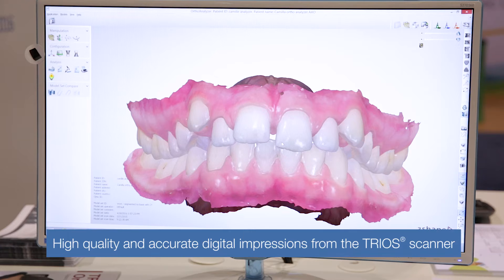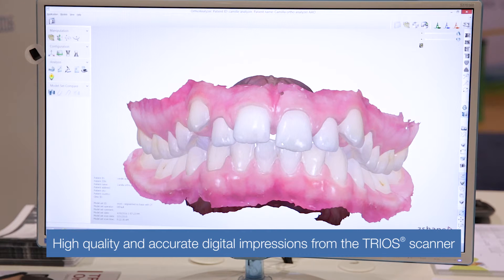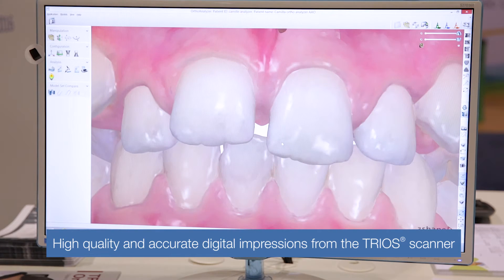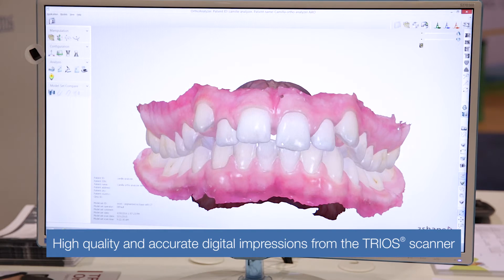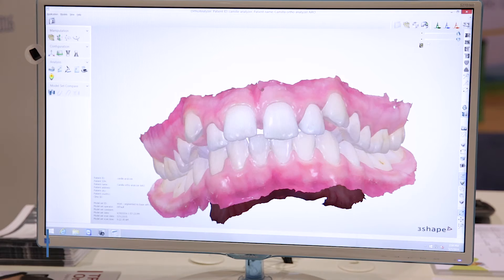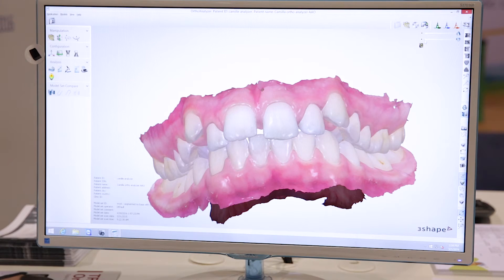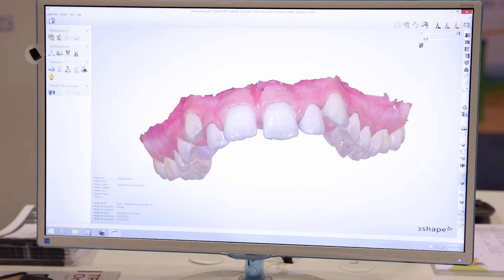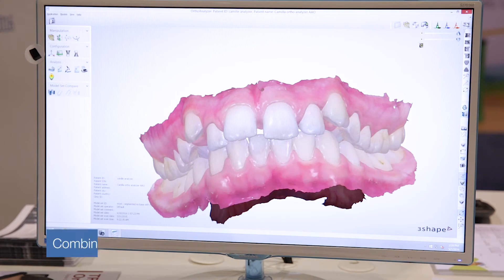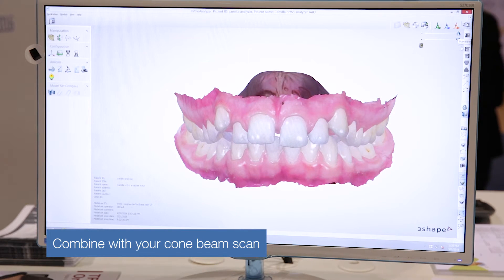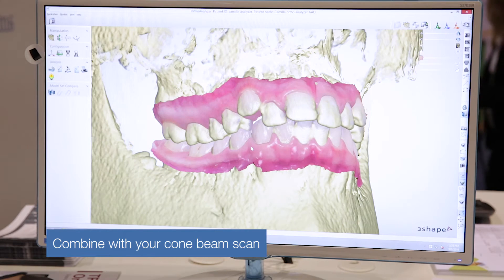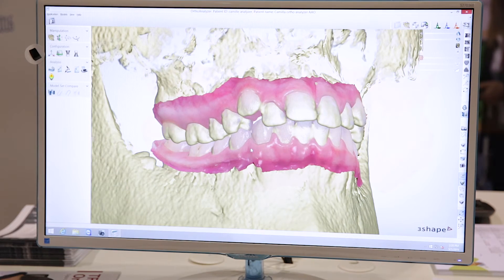You can see here this is a scan that comes directly from the TRIOS intraoral scan. It's really, really high quality even if I zoom in here. It's a completely digital version of the patient now. You can move it around, you can shut off the mandible if you want and put it on again as well. If you do have a cone beam scan as well, you can even superimpose that on the intraoral scan so you can really start creating this digital patient.